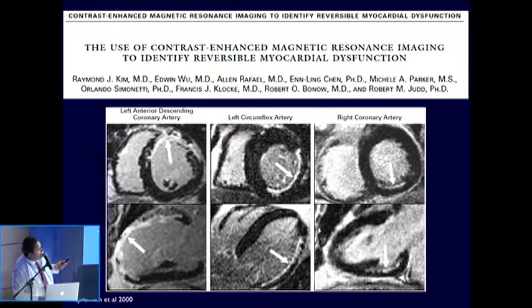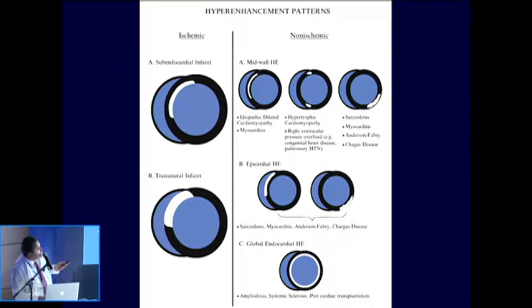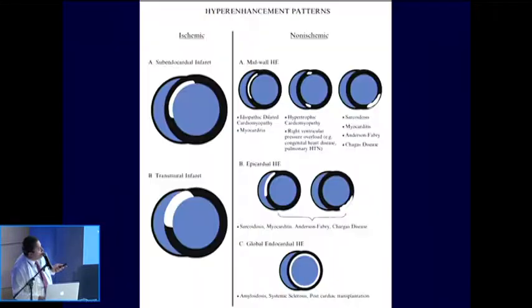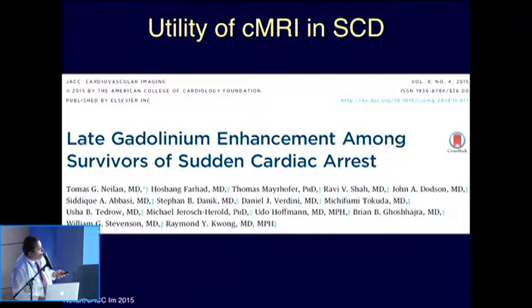And this is the ischemic pattern, which was first described by Kim and Judd, after the initial work in dogs. They went to Duke Medical Center. These are transmural infarcts of the anterior descending, not even one bit of normal tissue. All this tissue is infarcted. And here, a subendocardial infarction of the circumflex, and here an inferior infarction, which is the one with the shortest extent. This is the distribution of the ischemic tissue. Ischemic subendocardial may be very small, as the one I showed you here, or a bit larger, or it could be transmural, as the one that we see here.